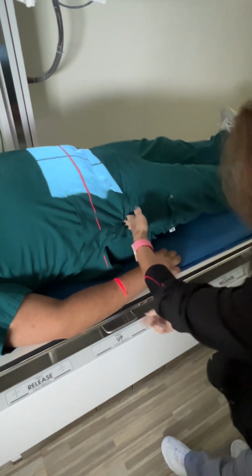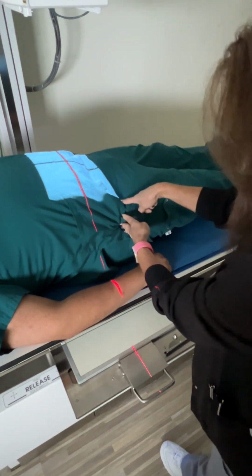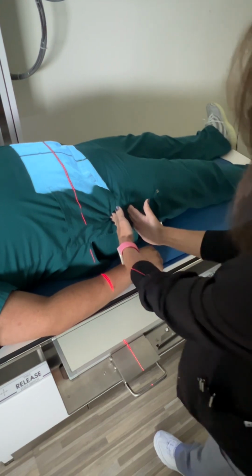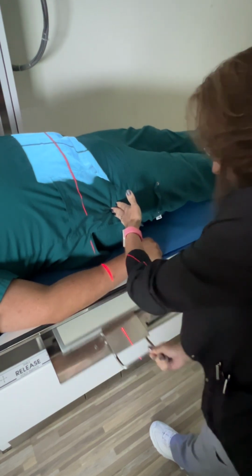So greater trochanter is here, but if I pull this out, we can see that my IR, even though it looks like my light field ends here, in reality, my light field ends about here. You can see where the image receptor, not my light field, the image receptor is placed there. So I feel like with that, I'm pretty good.